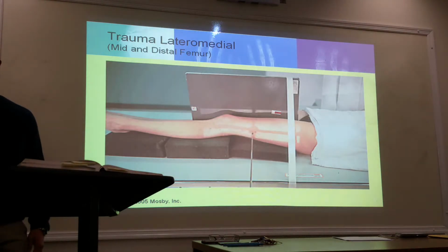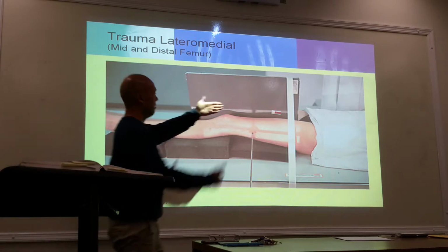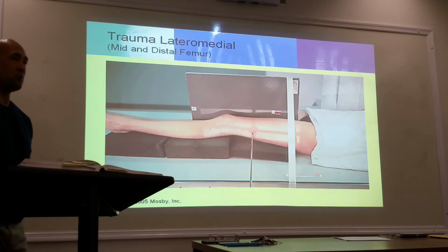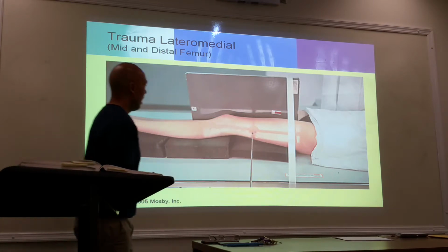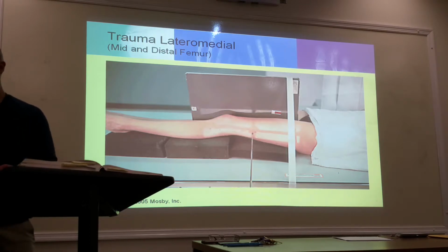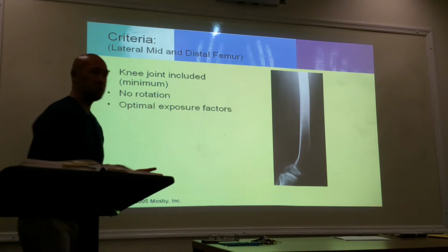Is the image receptor triangulated with the femur, or is it parallel to the femur? Everything is going to be perpendicular. It looks like it has an angle, I know it looks that way, but again, it's just the point of view of how the picture was taken. Here they were using some kind of support to hold the cassette up. You have grid holders. You have a multitude of tools in your department that you can use to hold the cassette up. Any questions?